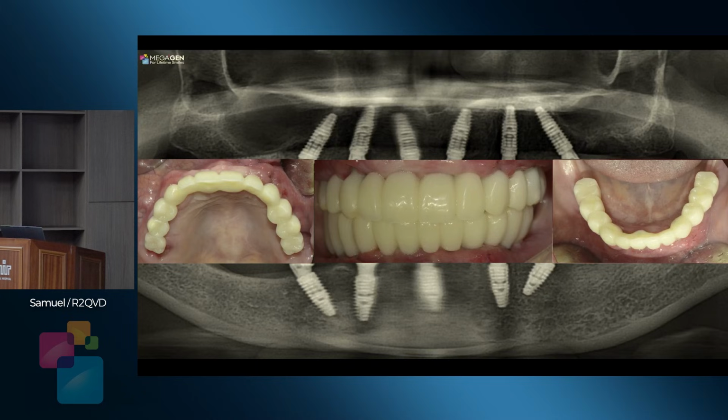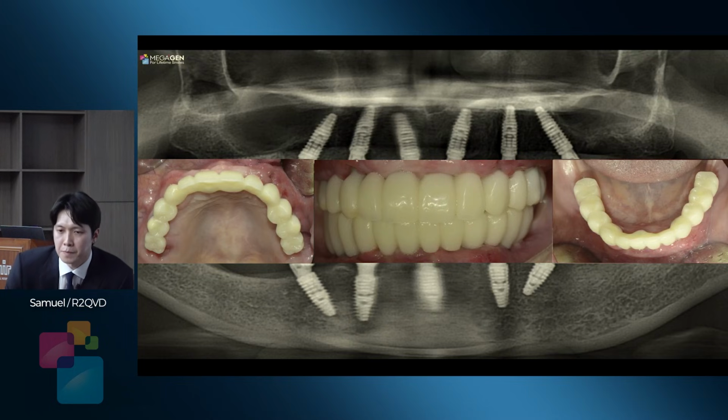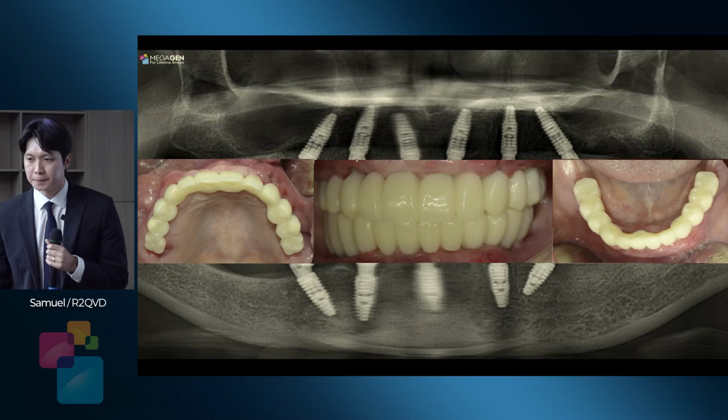My other question is, how would you feel if we shave this, is there a minimum? Do you have to have PMMA cover or zirconia covering the whole height? Or can it be beveled? Sorry, can you say it once again? No, this is your AXA, right? Let's say, this way.